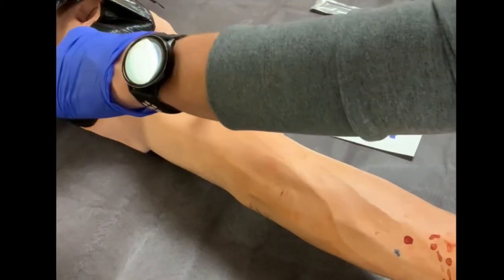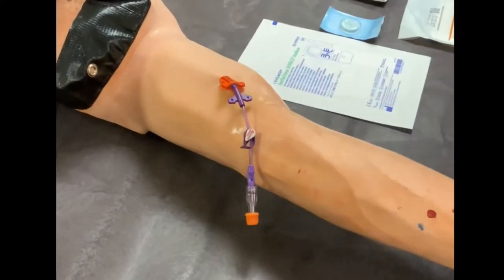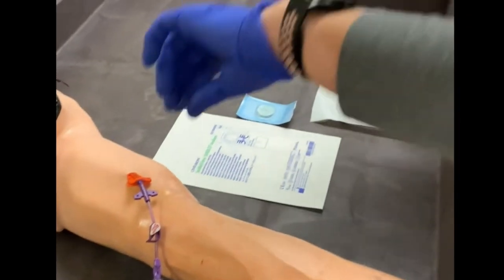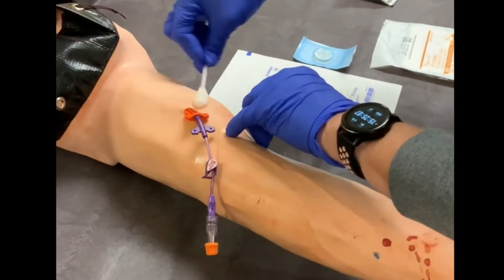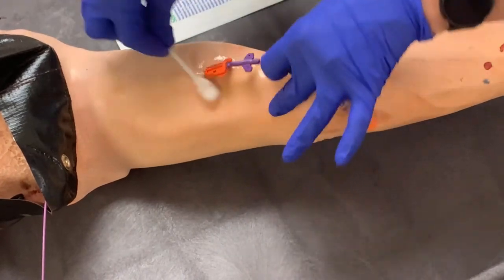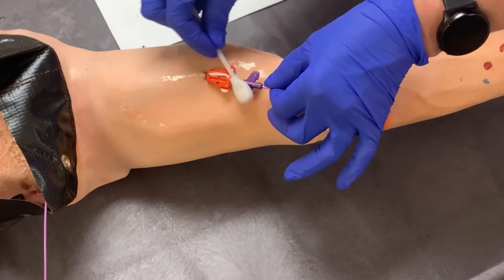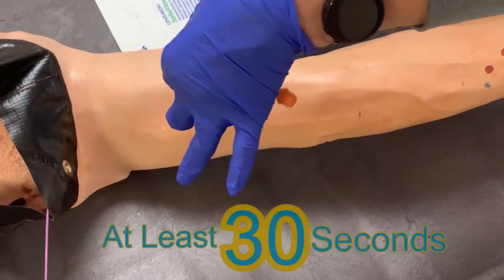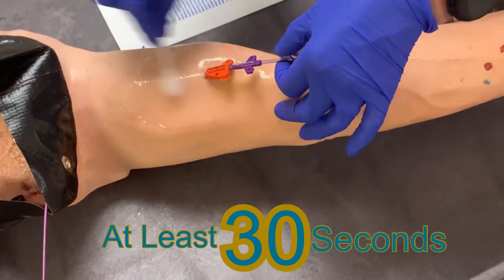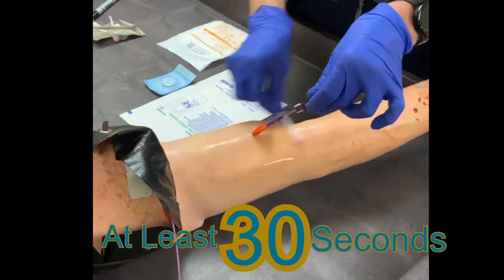The SecuraCath functions to hold the line in place. It anchors the device under the patient's skin and allows the device to be safely repositioned without the risk of slipping it out of position within the patient's vein. This is useful when cleaning the site because it allows for 360 degrees of disinfection. You will need to disinfect the area by scrubbing with your second chlorhexidine swab back and forth for at least 30 seconds. You can move the device as you disinfect around the entire area. Also be sure to disinfect the SecuraCath itself and the hub of the catheter.